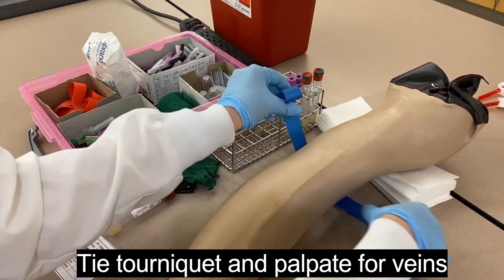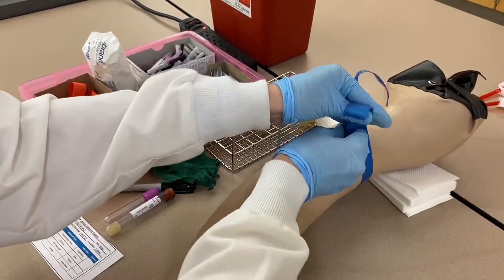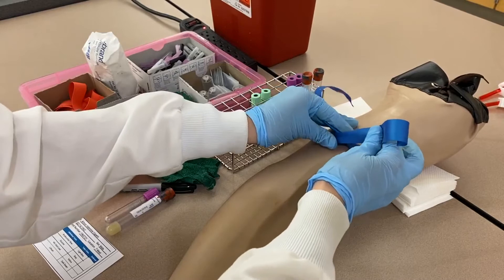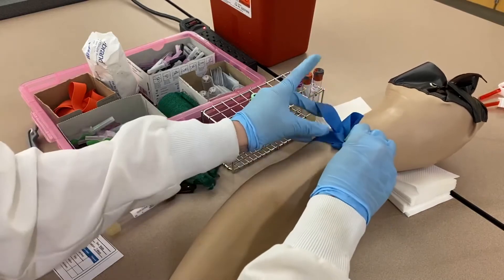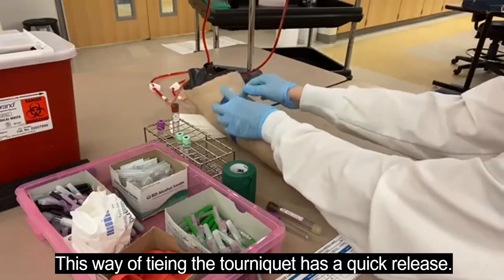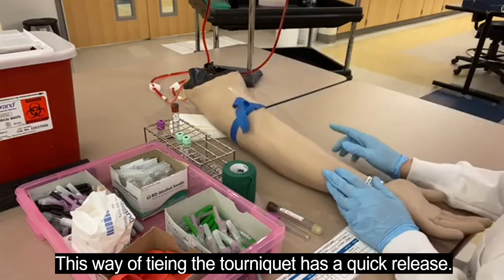You always want to make sure the tourniquet isn't twisted. Pull it away from their skin so you don't pinch them. Clasp, tuck the left tail under the right tail, pinch it between your left fingers, then tuck in that tail with your index finger. Today we have a quick release right here, which is what we pull to release it during the stick.